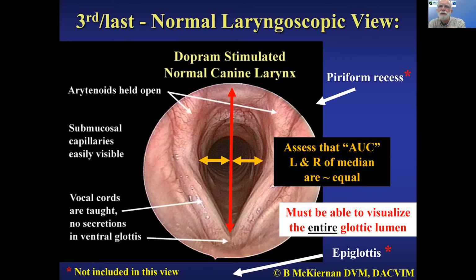It was one of those cases of getting rid of your dog because he barks. And the only thing at the time, and maybe on rare occasions we still do, is a debarking procedure. But there is a way to debark on the upper aspect of the vocal cords without going, you see the image in front of you, if it's still showing, the ventral aspect of the larynx. They web because you go too far down on a debarking procedure and you have raw tissue that's opposing, that scars, and it's under tension as the larynx opens and closes. And so it builds up and up until it's able to stabilize the larynx under tissue pressure. So I'm not sure if I answered that or not, Dave, did I? Yeah, I think so.